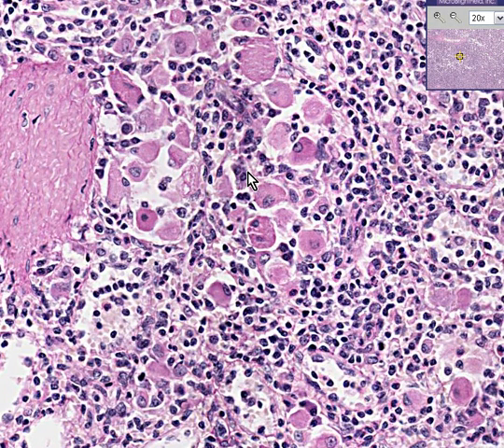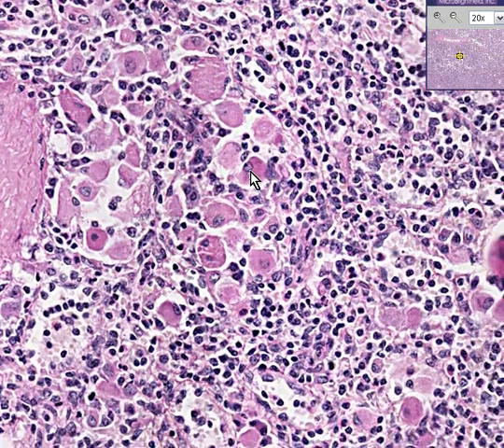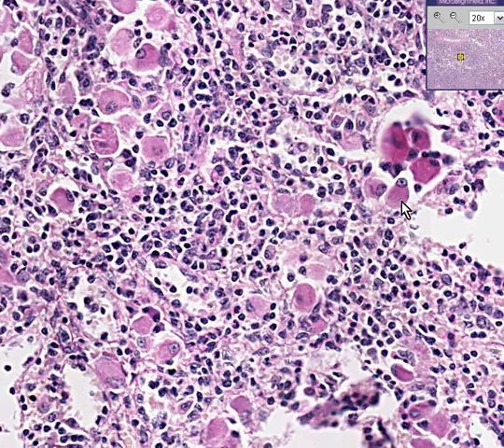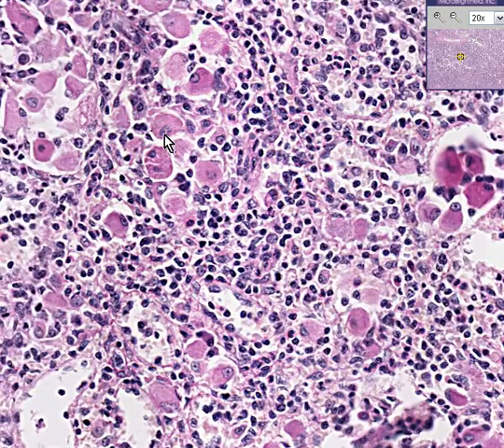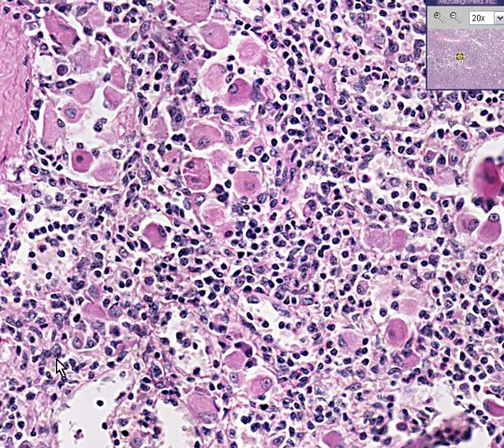They're any place where there are a lot of macrophages. So whenever you see these foamy, fuzzy pink cells all over the place where they shouldn't be, think that they might be loaded with glucocerebrosides because of the deficiency of the enzyme glucocerebrosidase. You can call this Gaucher's disease. Thank you very much.